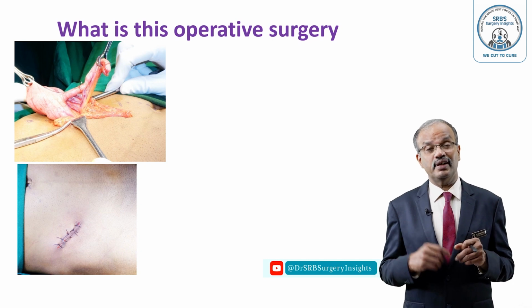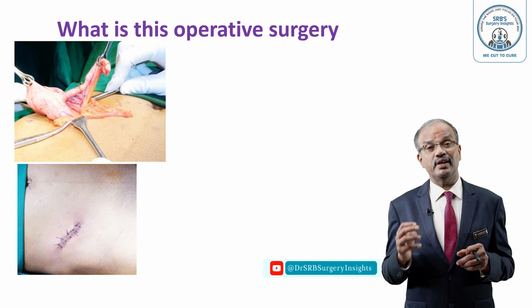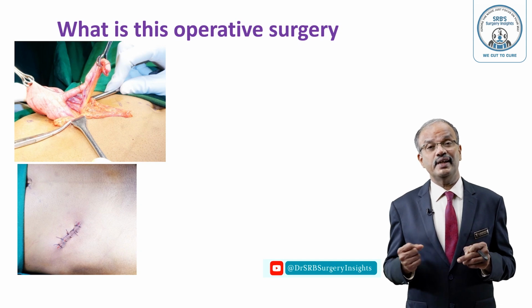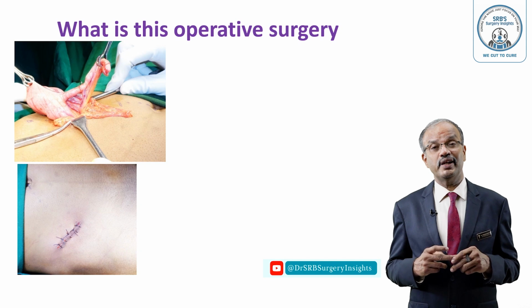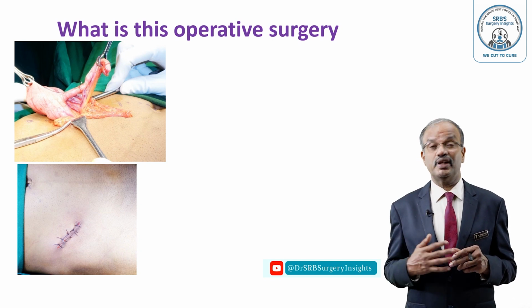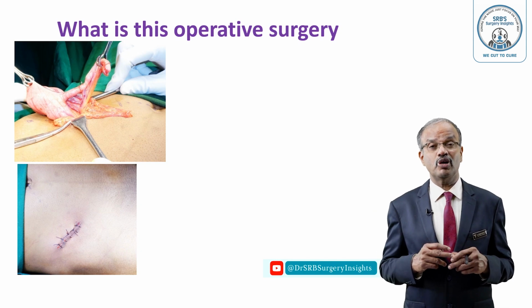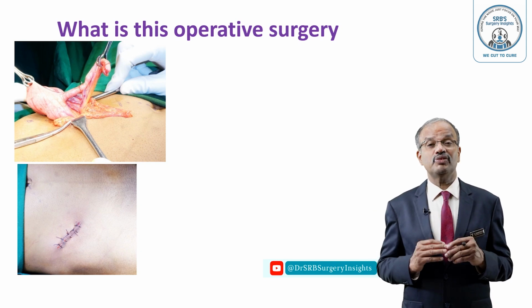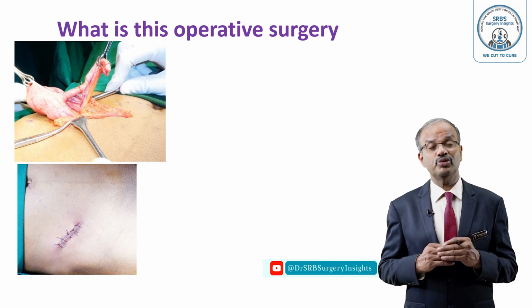Gently dissect it, and if any adhesions are there, release them from the appendix, then clamp it and ligate with vicryl or silk. The appendicular artery should be properly and securely ligated, otherwise bleeding occurs, torrential hemorrhage, and eventually reactionary hemorrhage can occur. Then lift it properly and reach the base of the appendix with proper dissection. Once you reach the base of the appendix near the cecum, crush it with the artery forceps, which makes the mucosa oppose each other.